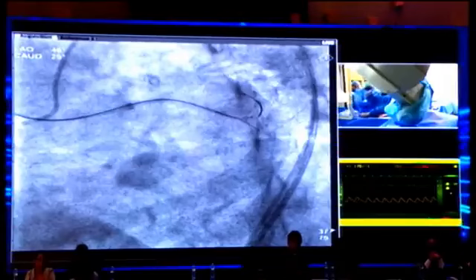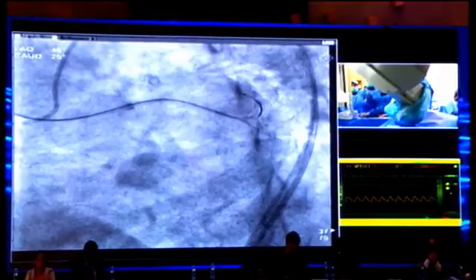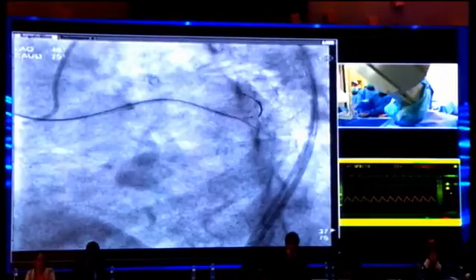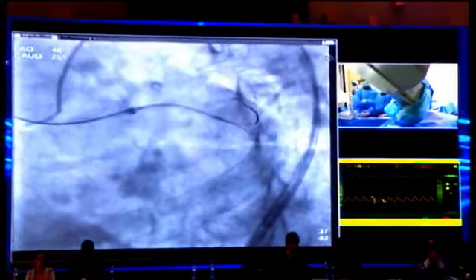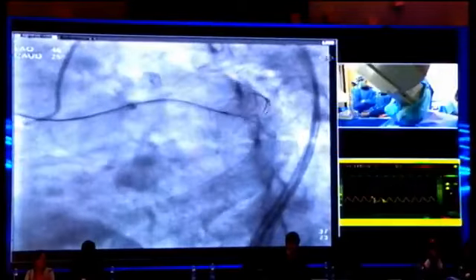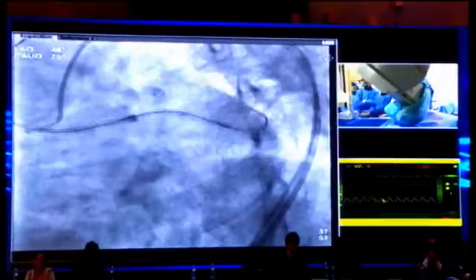Okay, any comments from the other panel? No. Run, please. In this flow image, please run this. Dr. Nagamatsu? Yes? You mean you want to advance the Gaia second to the distal circumflex, not the PL? Yes. You mean the circumflex.